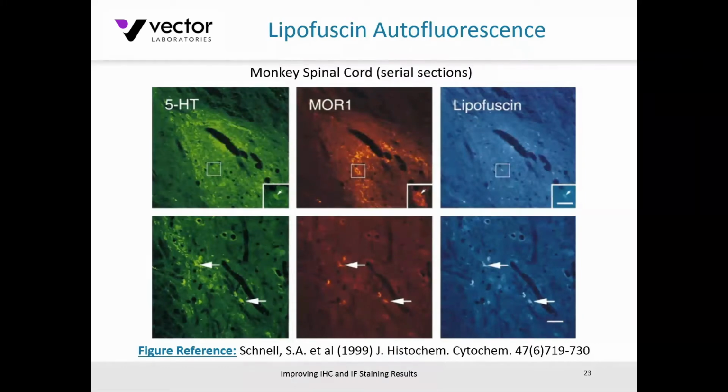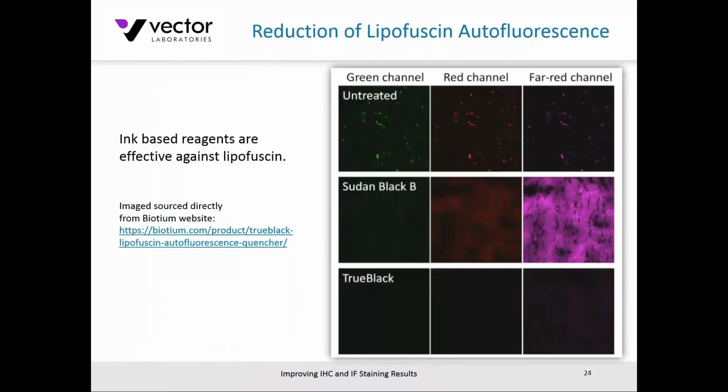Now, I pulled this particular image from the reference I've indicated below here. These investigators did report a double false positive due to the presence of lipofuscin, as indicated by these arrows here. Look at this 5-HT or MOR1, but unfortunately, it seems that lipofuscin was contributing to the interpretation of their results. So what do you do with lipofuscin?